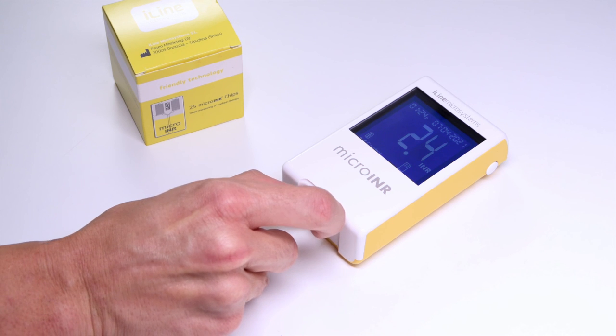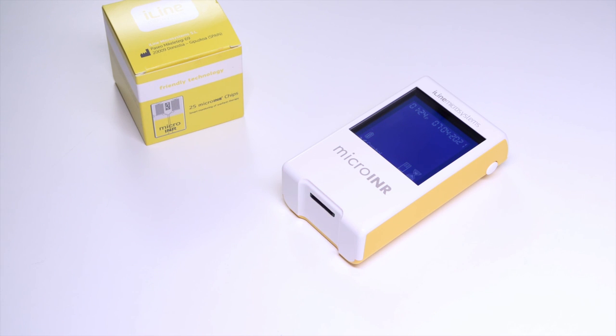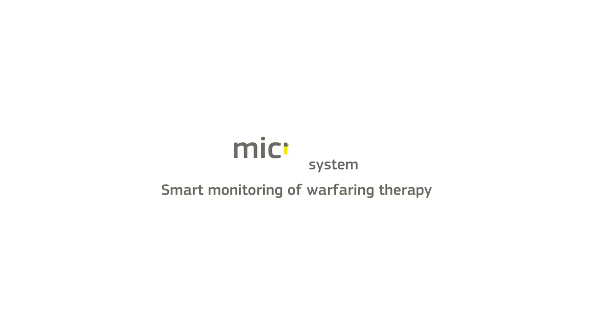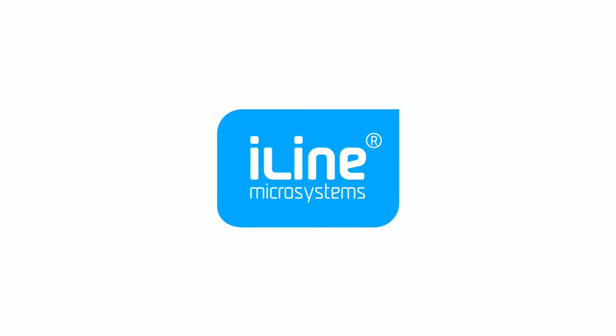Remove the chip holding the sides. If you need to repeat the test, perform the finger stick on a different finger with a new lancet and a new chip. Please remember that you must read completely the Micro-INR meter and Micro-INR chips instructions for use before using our system.